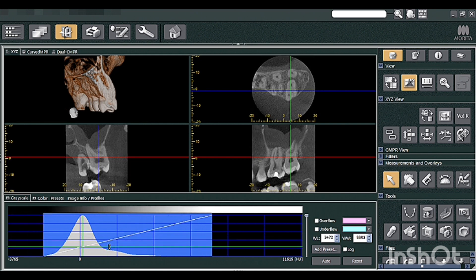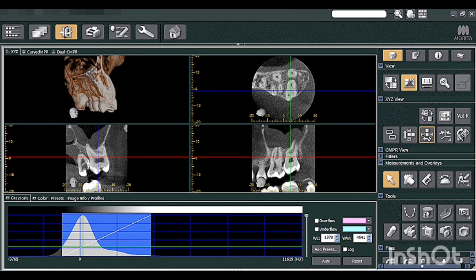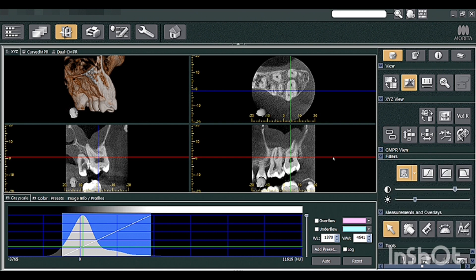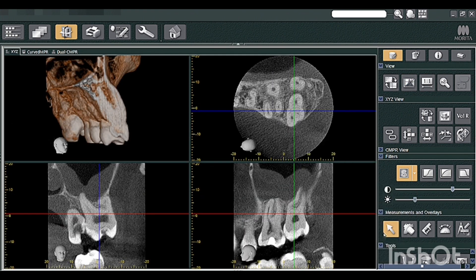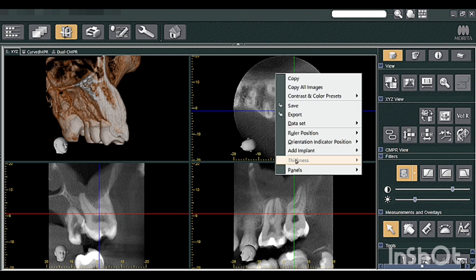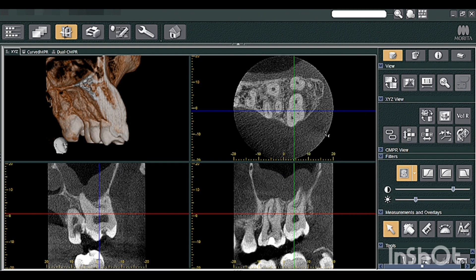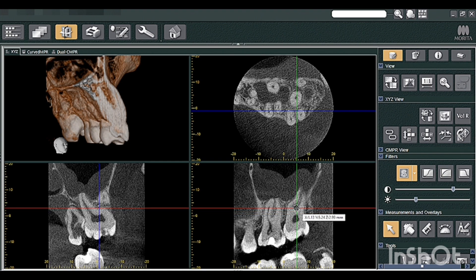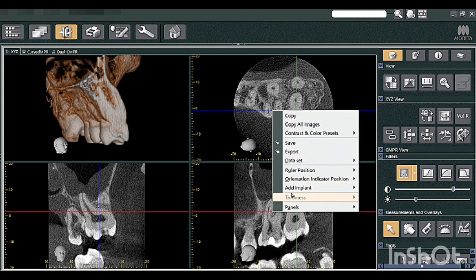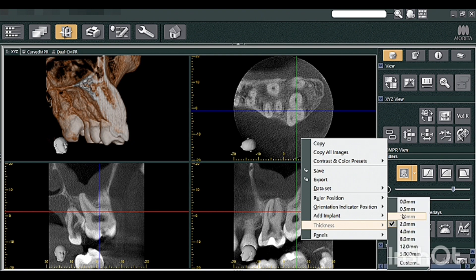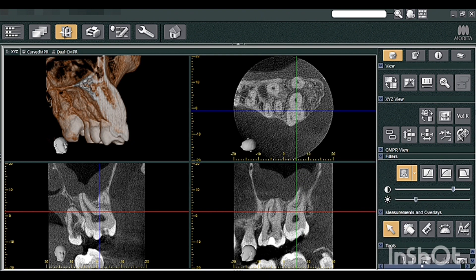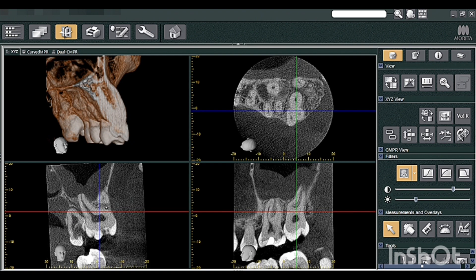We'll adjust the brightness, contrast, and sharpen the image a bit. We've added some sharpness filters and adjusted the brightness and contrast as well. You can increase or decrease the thickness for a better view. We'll take it at 0.5 mm thickness. When we decrease the thickness, image noise increases — you can see the granular image — so it's ideal to do it at 1 mm or 2 mm thickness.